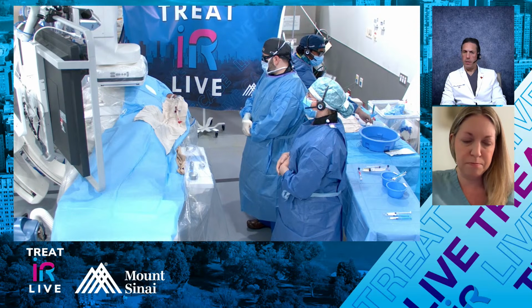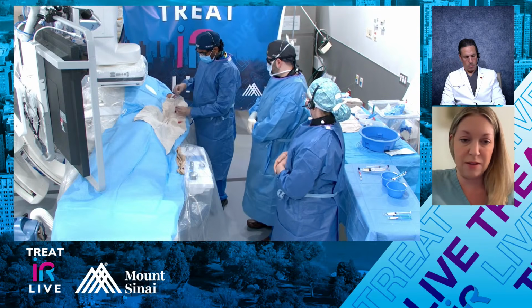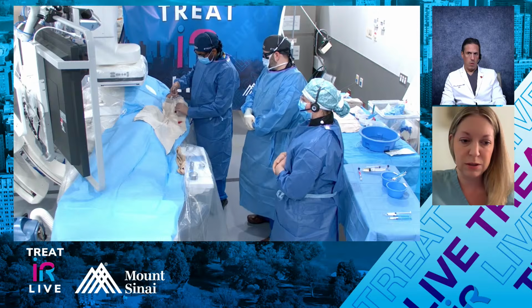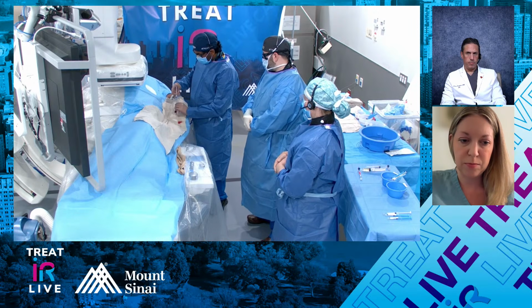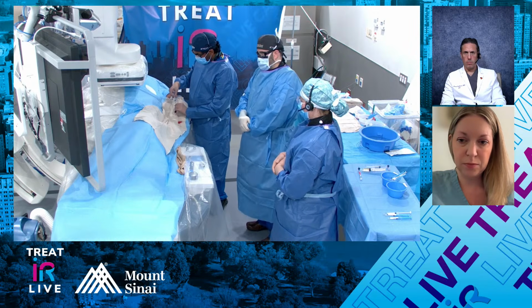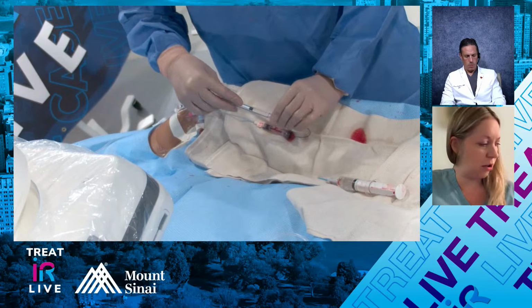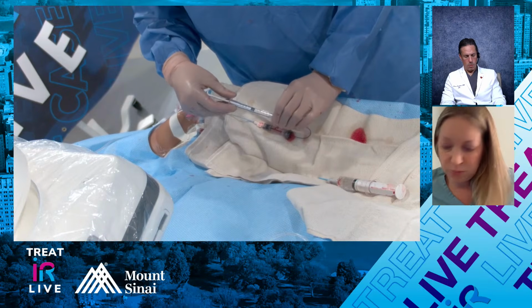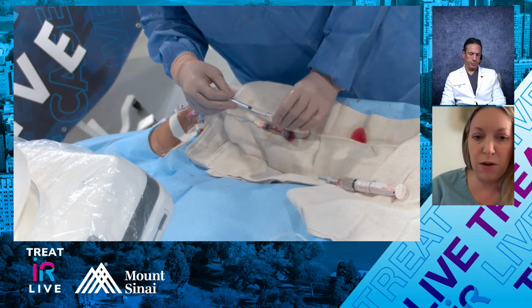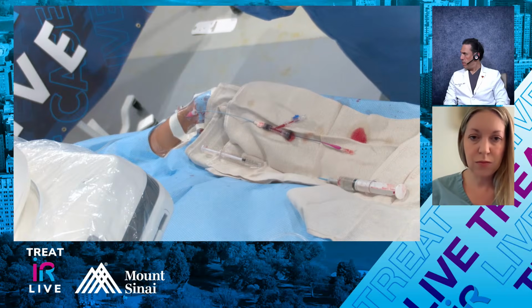Based on where we are right now, it looks like Jay picked the perfect length there. That's also 110, so anything like that would be fine. Right now I have a 125 catheter and a 150 2.4 microcatheter through that. May be concerns about how tall she is? She's like five, five, six. Not so tall, so you might be okay.